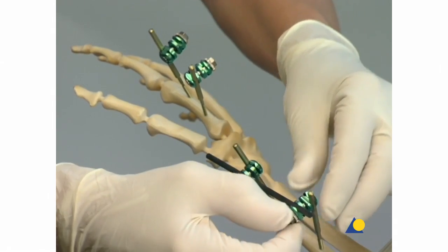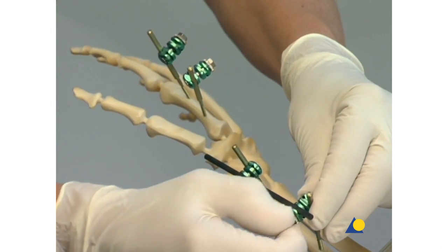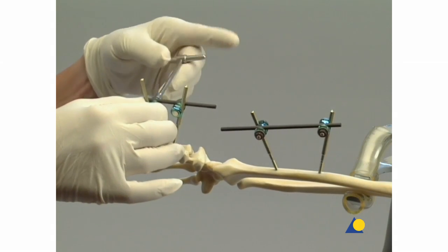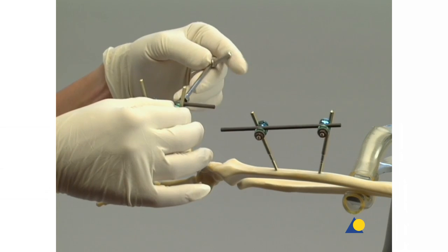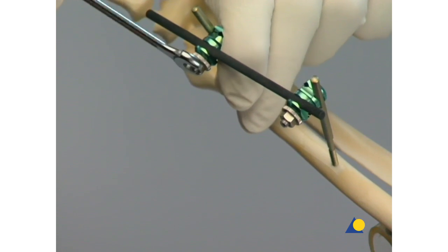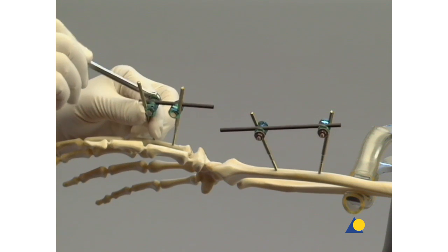The clamp nuts are tightened first by hand and then with the 7mm socket wrench. Final tightening is completed with the 7mm combination wrench.